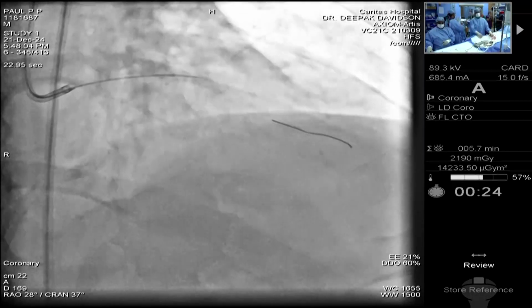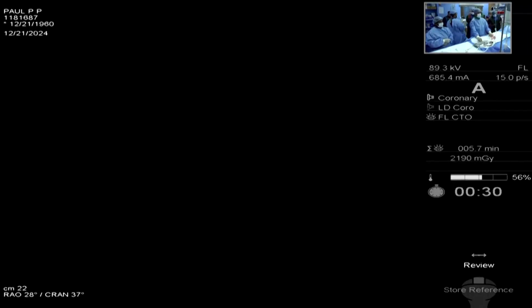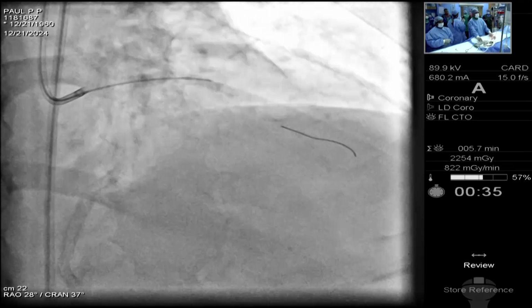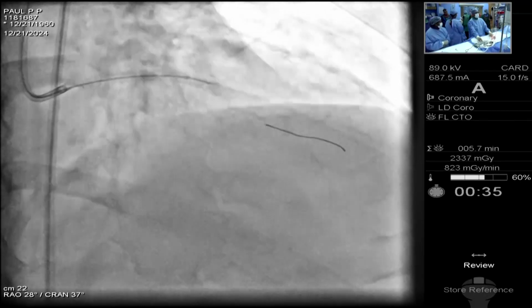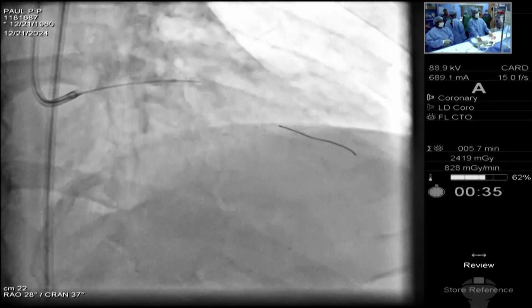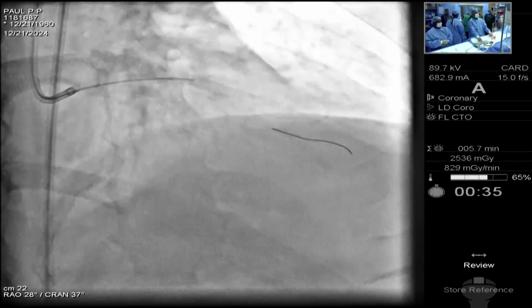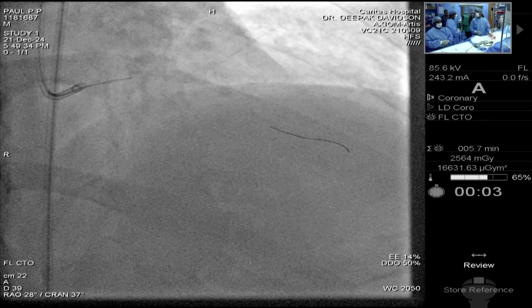The sleeve is actually 3.5 French. So even though it goes in easily through a 7 French catheter, it will be occupying the entire lumen. When you move this forward and backward, there is always a chance that because of the Venturi effect, you tend to have small air bubbles inside the guide catheter when you take the sleeve out. So as far as possible, if you don't see significant STT changes or hypotension, better not to inject. We'll be tempted, but while doing rota we never do that unless it's really indicated. Let it come.